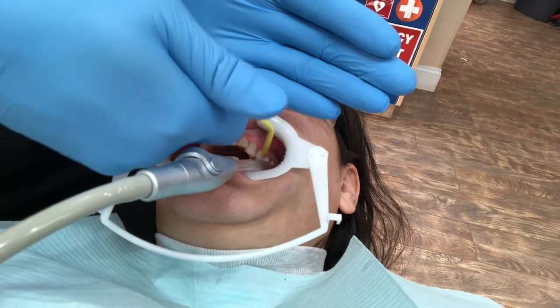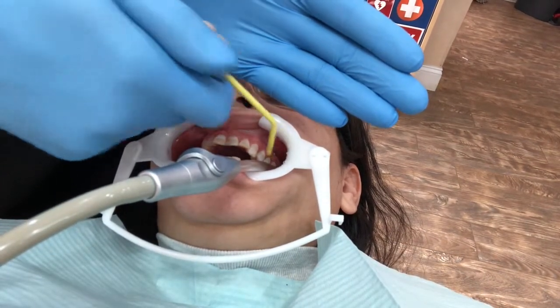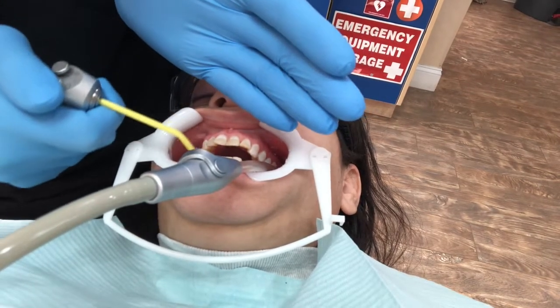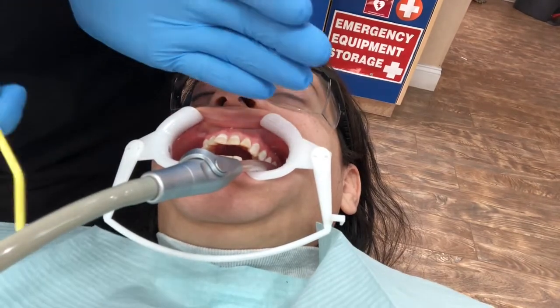Just file a little bit until it's not sharp and not cutting you up on the inside of your mouth, because you are gonna have to take off your trays to eat. Do not eat with your trays — it's just gonna stain them, cause more cavities, and think about all the bacteria.